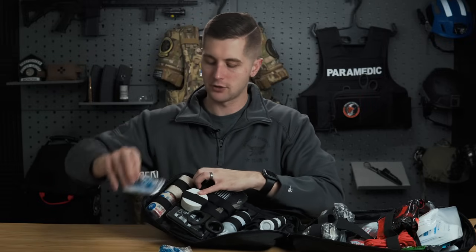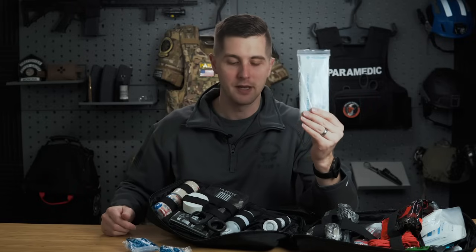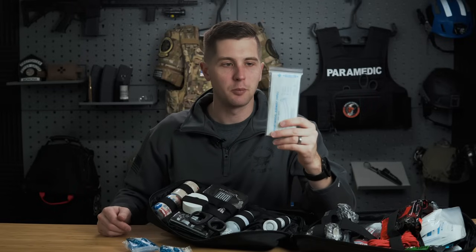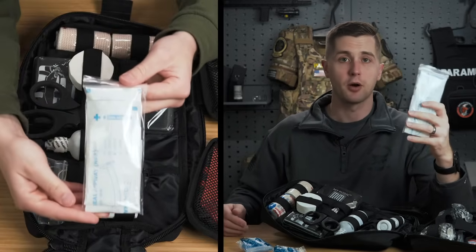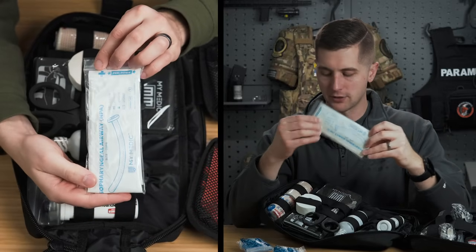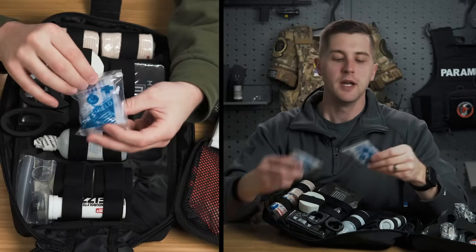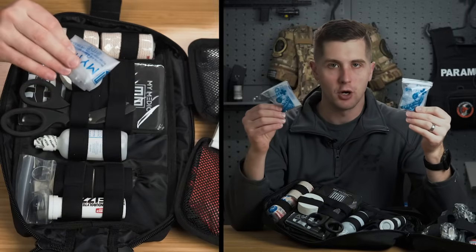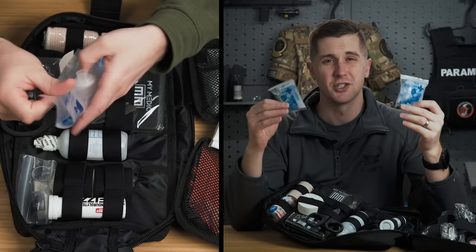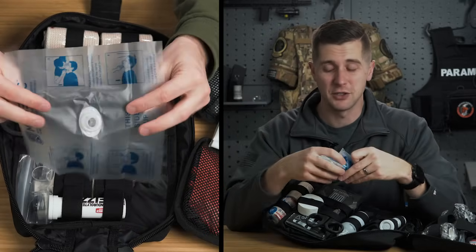And I almost blew past it. On this top pocket underneath the splint, like I said, more hidden pockets, we do have an NPA. Generally, I'd like to see this a little bit more easily accessible because this is part of our initial MARCH algorithm, our airway, where we might need to throw this in a hurry. But as long as you know where it is and you train with it, you're good to go. And then we have two CPR shields in there. That's just a barrier device to keep you from going mouth to mouth, which is not a great thing to do.